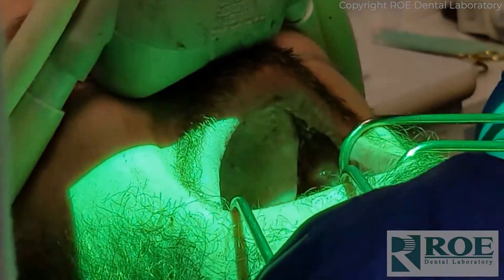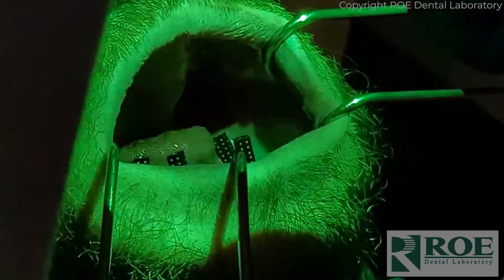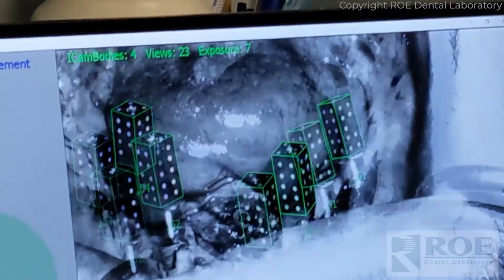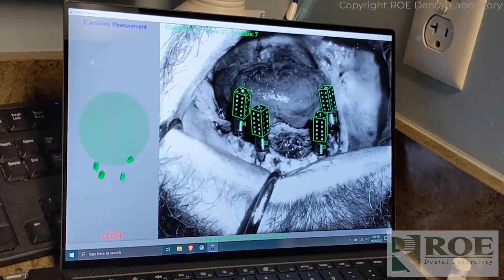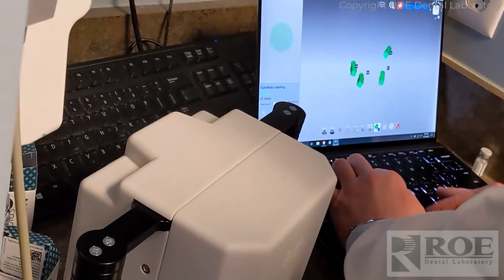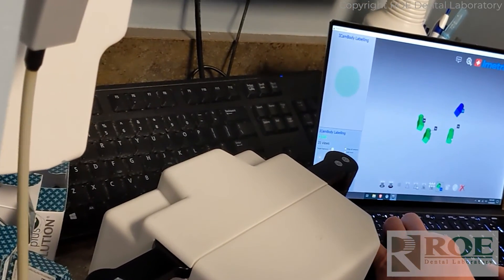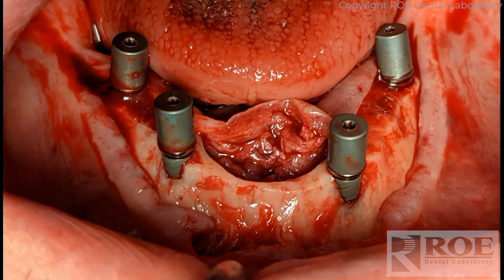In case you haven't seen the process — the scan bodies are screwed into the MUAs, and then using the ICAM scanner, the scanner will identify the domino-shaped scan bodies in the mouth. It will identify them perfectly. It's a perfect reference, and the doctor will use some software to register those scan body references to the scan refs.